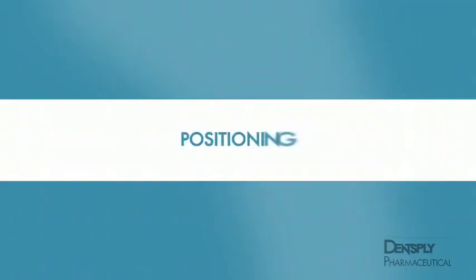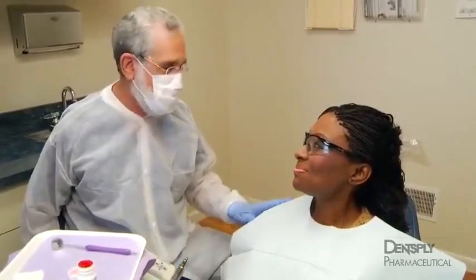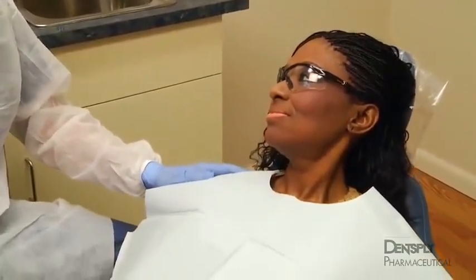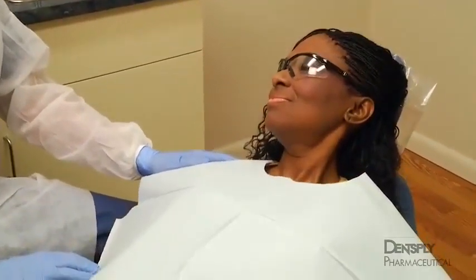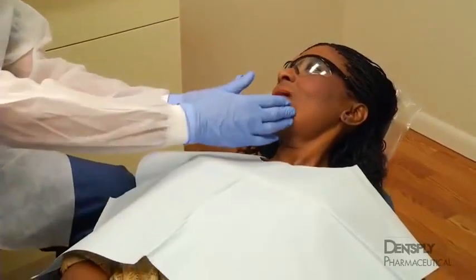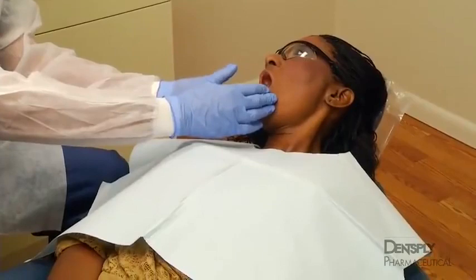Patient operator positioning. The proper position for the dentist and patient during the administration of mandibular anesthesia is similar for all of the injection techniques reviewed in this program. The patient should be placed in the supine position, with the legs slightly elevated. This position will avoid many of the psychogenic reactions encountered during the administration of mandibular anesthesia.